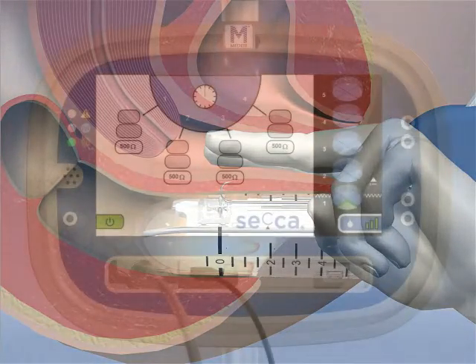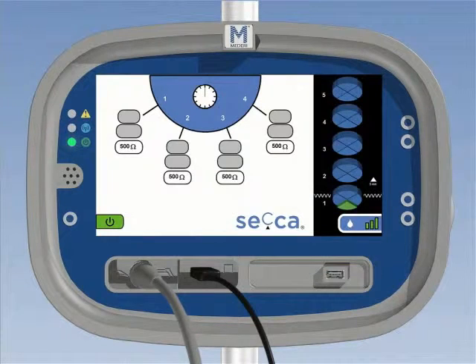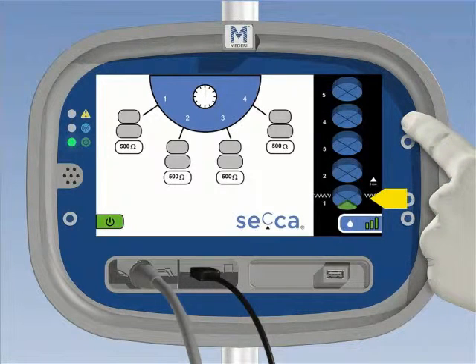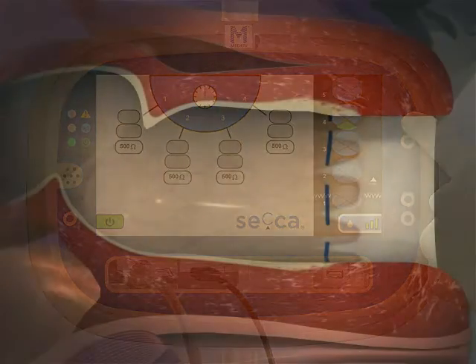If the rectovaginal wall is deemed too thin, the physician should avoid treating this area or place fewer treatments in this quadrant. To manually skip treatments in this quadrant, depress the forward skip button once for each treatment site you wish to skip. Additionally, the physician may skip individual treatment sites in any quadrant using the same button.